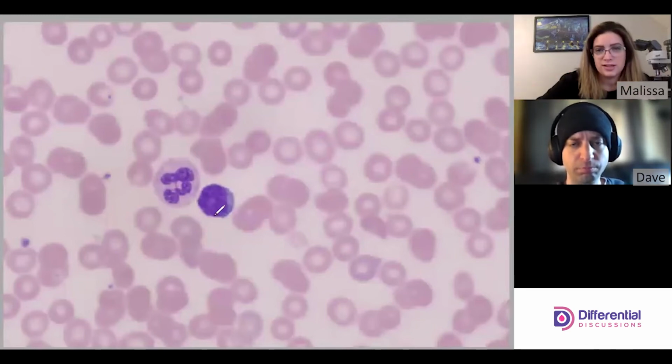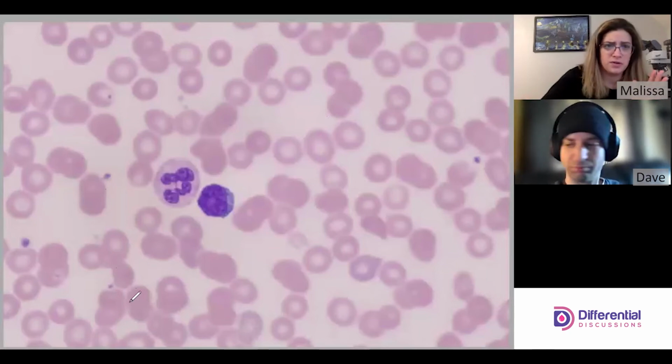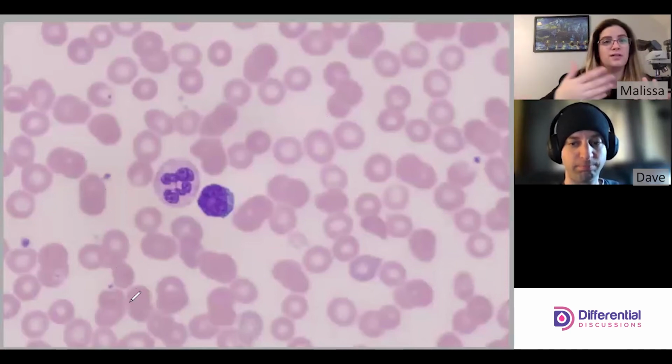So you can see that this guy here, this nucleus, is more on par with this guy here as compared to this guy and this guy and all the really significantly larger macrocytes that are in this field, which there are several. So using that small round resting lymph, if you can find one, because there's typically a ton of neutrophils in a megaloblastic anemia, and you see less lymphs in the peripheral blood smear. If you can find one, it's really helpful, again, if you don't have a ruler in your ocular.